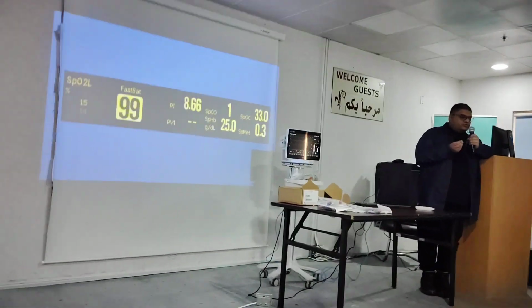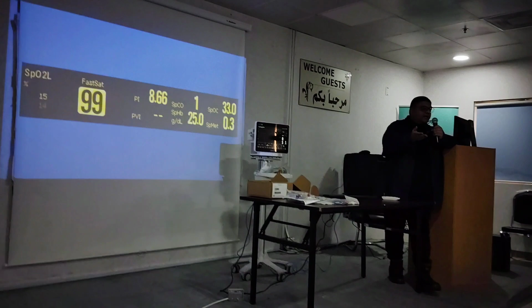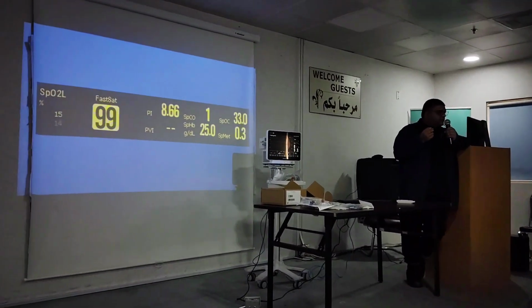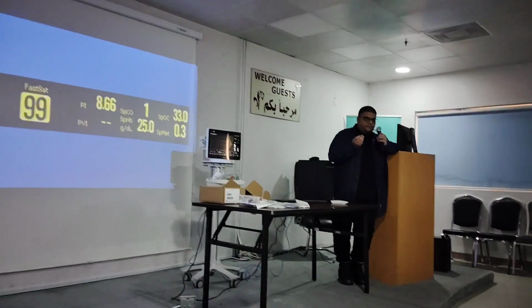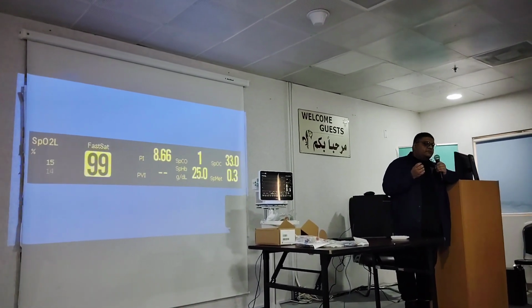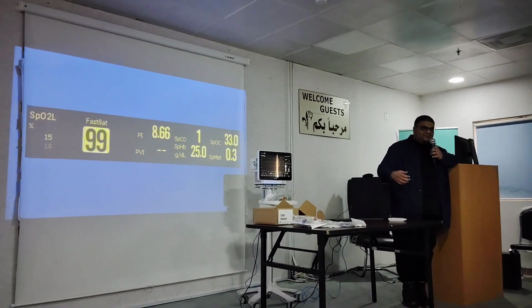And if your hands are too dry, that is also an issue. Henna also. Yes, absolutely. Any tattoos or any kind of discoloration, even if, let's say they bump their hand into something like this, and it discolors, that will also affect the SpO2 reading. So don't use that finger. First, if they bump their hand into something, that finger might hurt. So maybe it's not a good idea to use that finger in the first place.